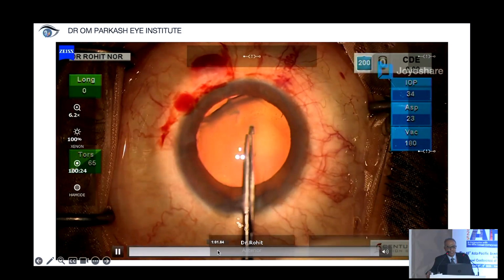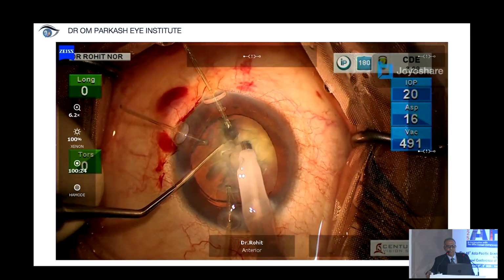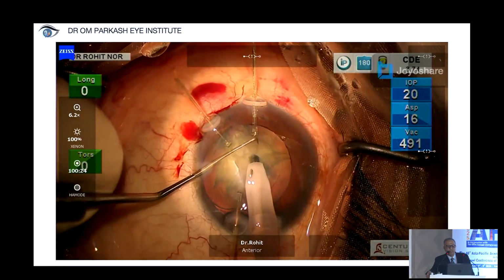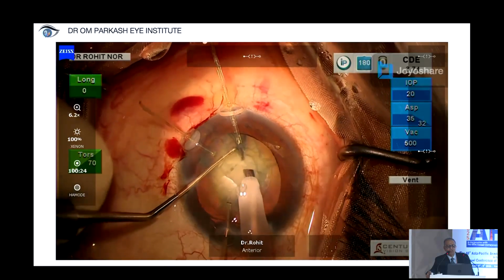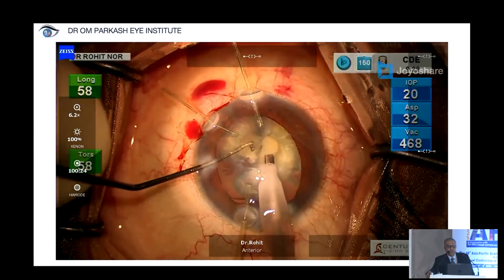So I had reached here. Now I'm continuing, chopping it. Now doing sort of reverse chopping, as Ronald Yeoh initially, our own Dr. Chee, had shown. So now I'm rotating it.